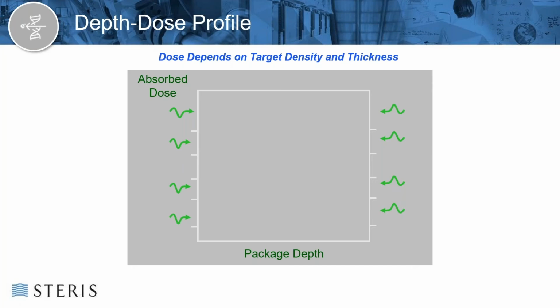And for this particular product, of this density, and it's pretty uniform, we get a nice dose profile. We get this depth dose plot, like you see here. What you see is a reasonable representation of it. And we're getting certainly past the middle of the depth of the product in this particular situation. So that looks pretty good.